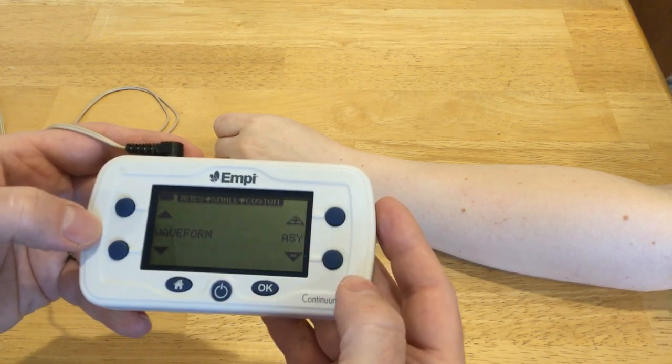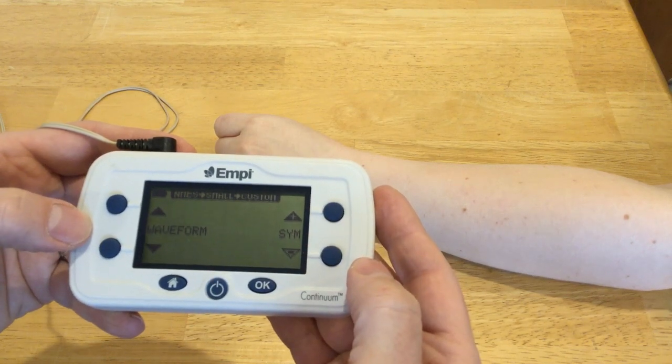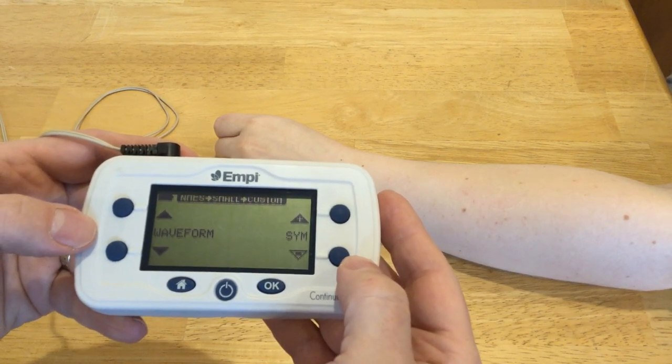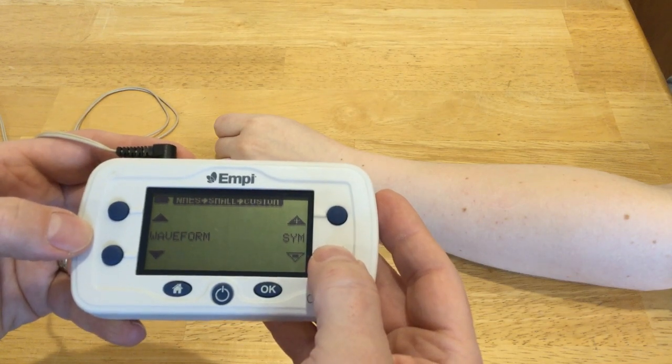Then it says what waveform do you want — an asymmetrical waveform or a symmetrical waveform? If you use a symmetrical waveform, both electrodes will be equally active; they will both spend an equal amount of time being the primary cathode and the primary anode.